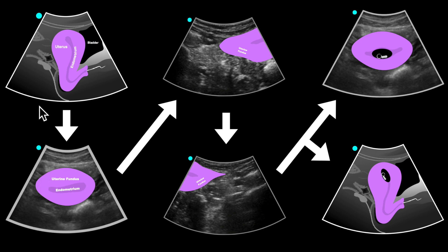We recommend starting in a uterus long axis view using the curvilinear probe with the probe marker faced towards the patient's head, starting midline and scanning from the patient's right to left. We then rotate to the patient's right and scan from the fundus to the cervix in a short axis view. Then we look at the right adnexa, left adnexa, and then focus on any pregnancy-related contents, abnormal adnexal masses, or free fluid.